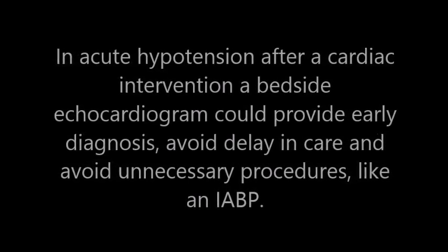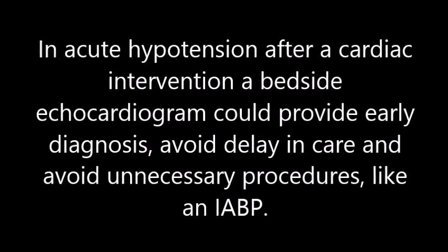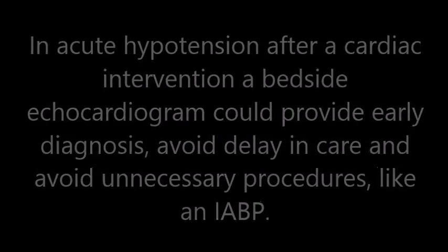In acute hypotension after a cardiac intervention, a bedside echo could provide early diagnosis, avoid delay in care, and avoid unnecessary procedures like an intra-aortic balloon pump placement in this case.